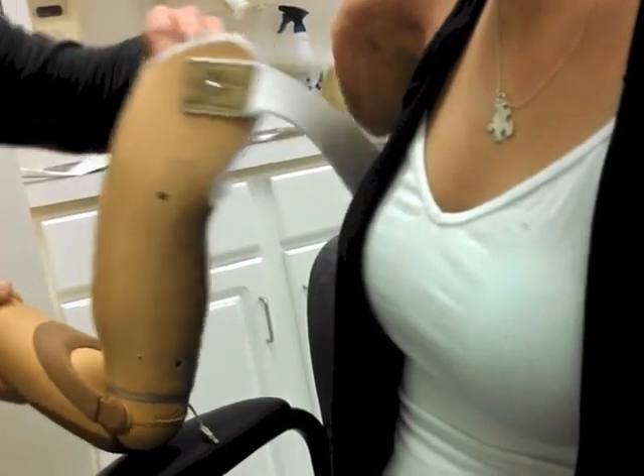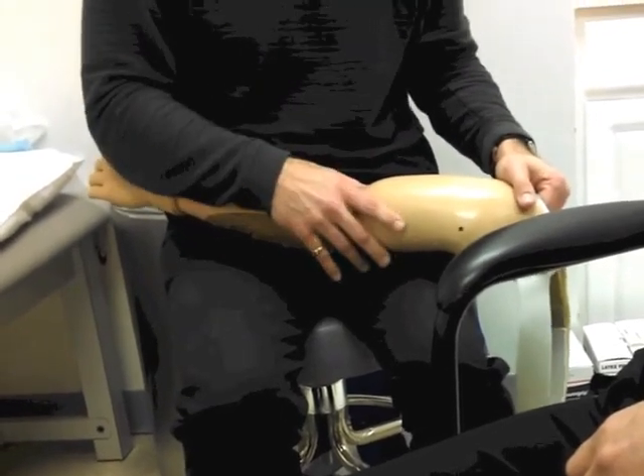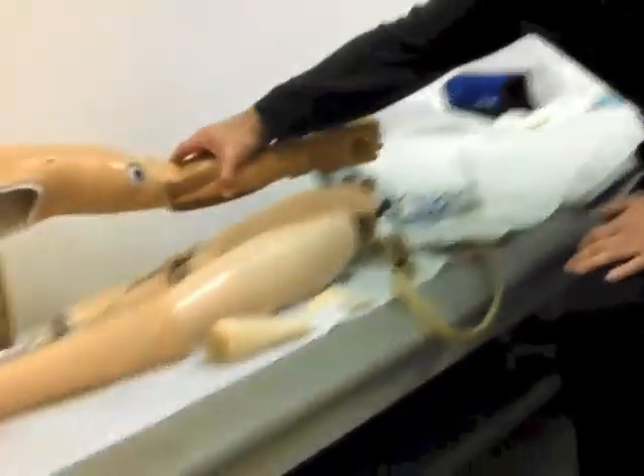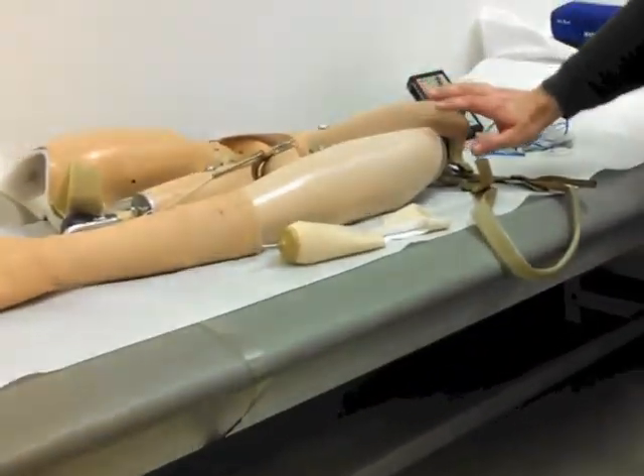The strap will feel a little odd at first. I see a lot of upper extremity amputees — in the Philadelphia area I probably see the most, though there are other companies that travel and see many as well. In reference to types, these are honestly the three types you're going to see most.